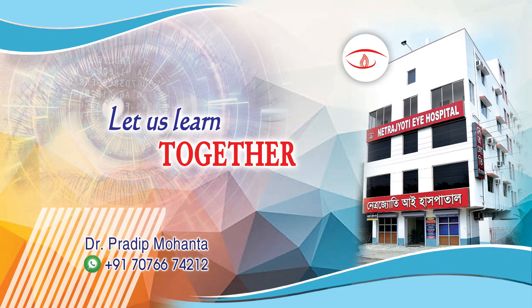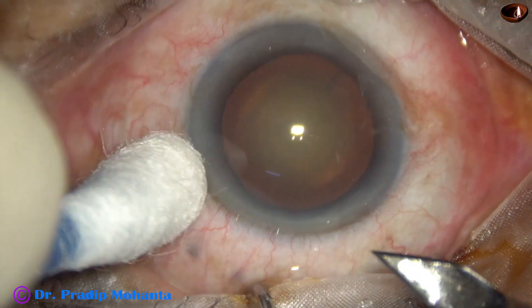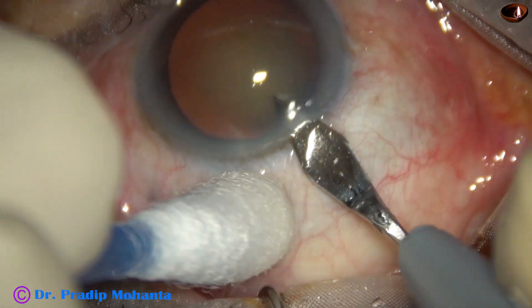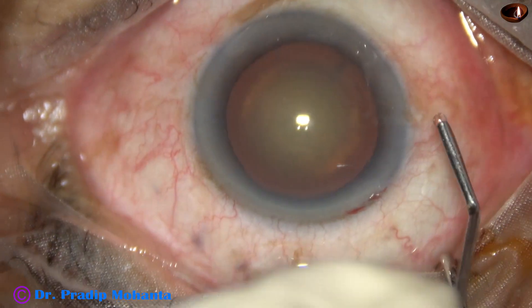Friends, welcome to my workplace at Rana Ghar, West Bengal, India. This is a cataract with grade 3 nuclear sclerosis. In this video, we are going to see direct chop and what to do when the iris gets incarcerated to the side port.